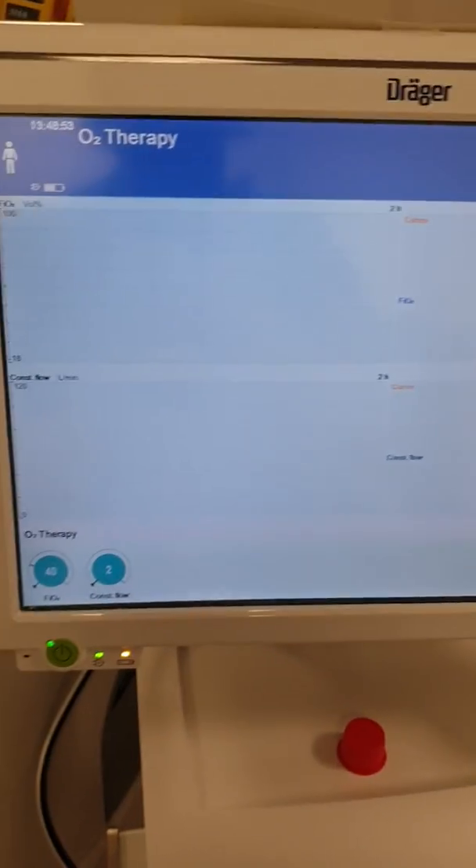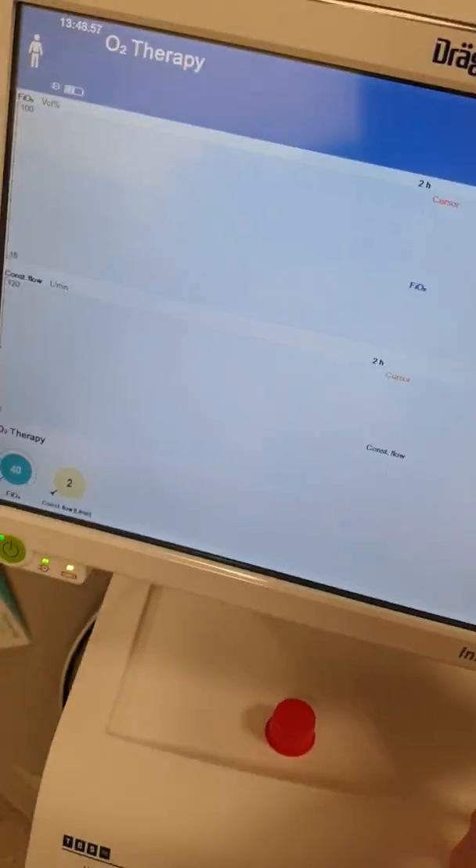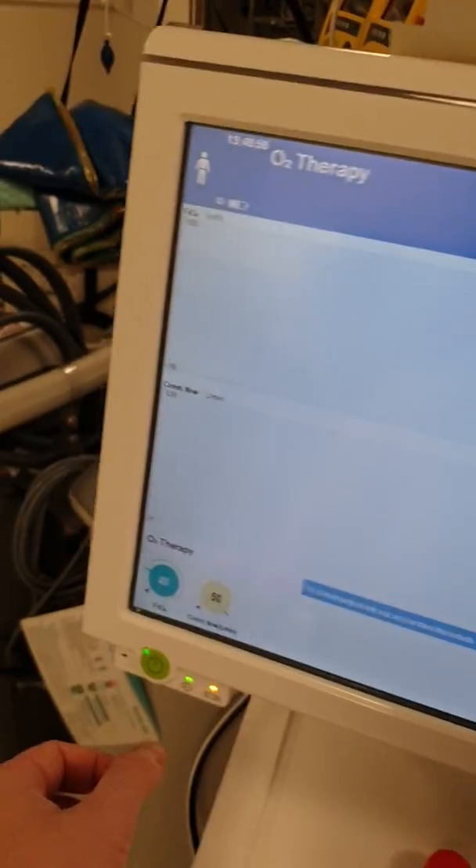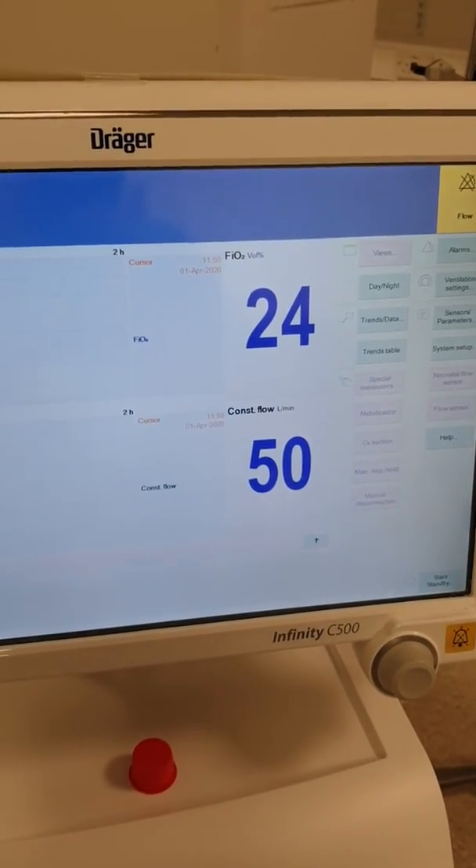So now we are in high flow with a flow of two liters per minute. Just to show you, you can go up to 50 — we confirm it, and we now have 50 liters per minute.